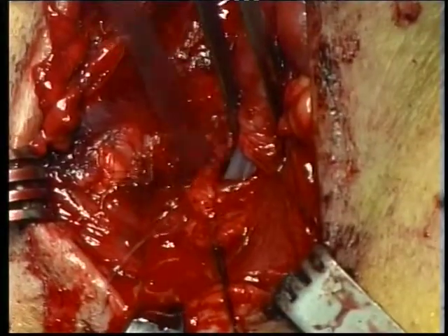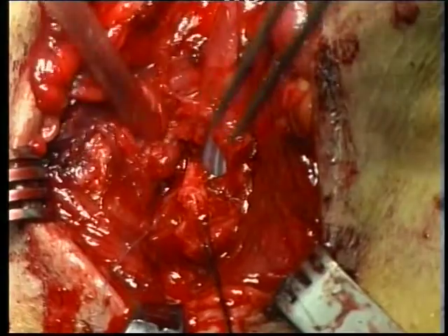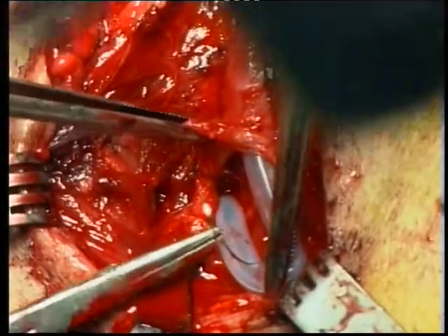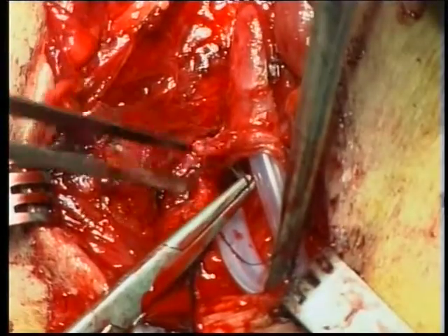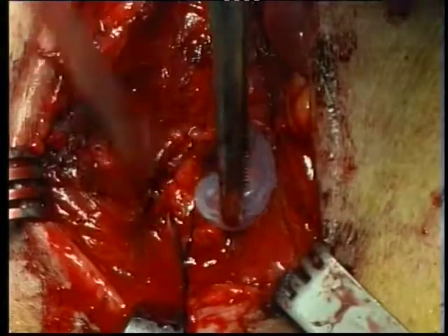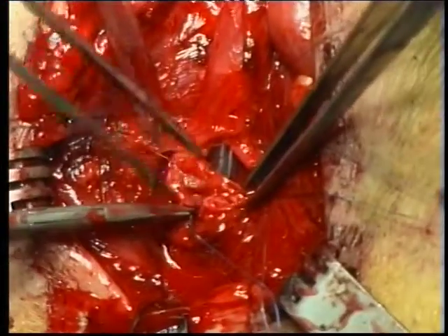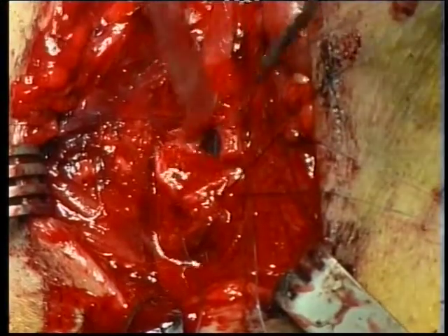The anastomosis is then continued around the urethral circumference with interrupted 4-0 Vicryl sutures that include both mucosa and spongiosum. 8 to 10 sutures are usually placed to complete the anastomosis. Sometimes it is necessary to excise bulbar spongy tissue to allow a more homogeneous anastomosis. The last stitches are tacked to improve the visibility of the mucosa, which is mandatory to include in the suture.